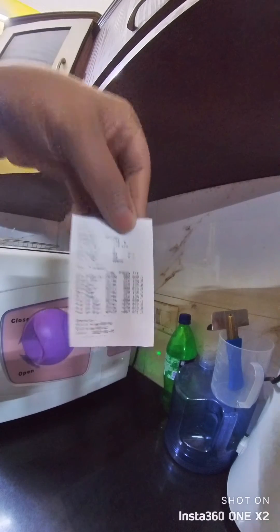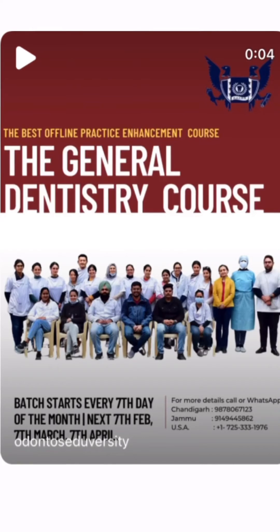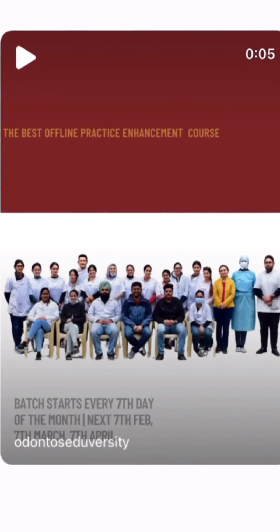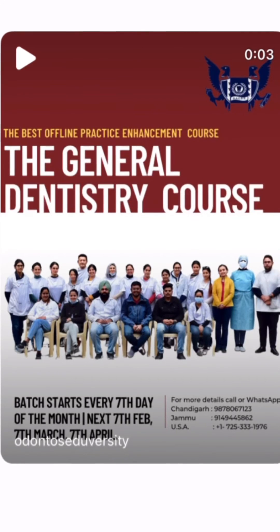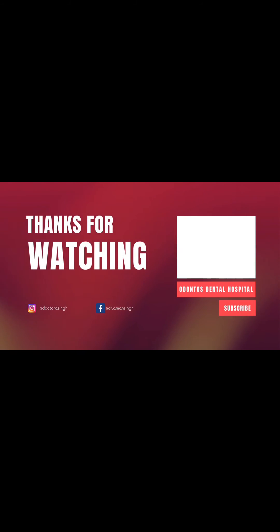This sticker gives you the full detail of the total sterilization cycle. I totally recommend this product — we should all have it for proper infection control in our clinics. Thank you very much for watching, stay tuned for more. Bye!